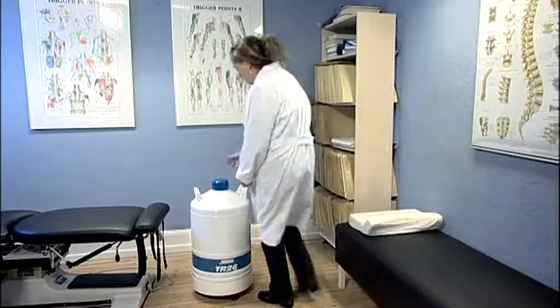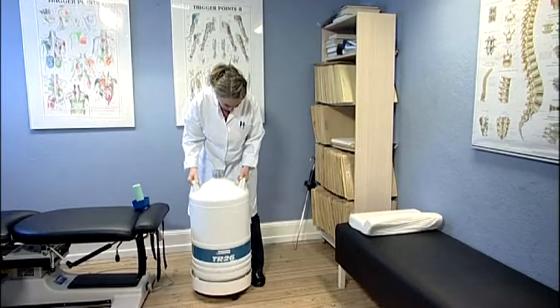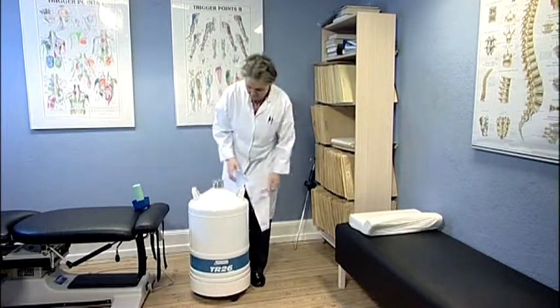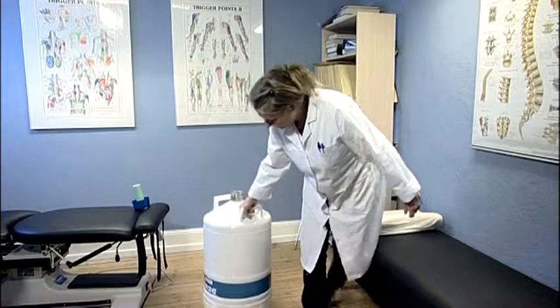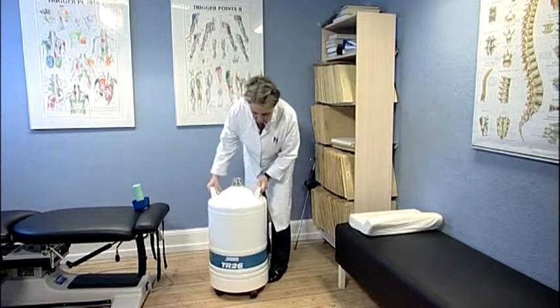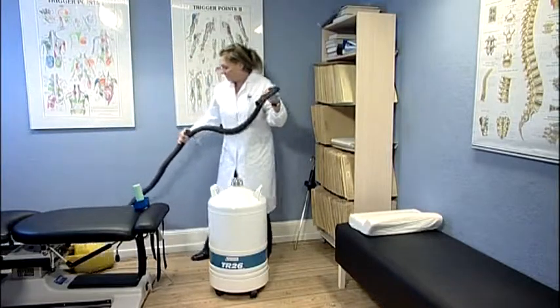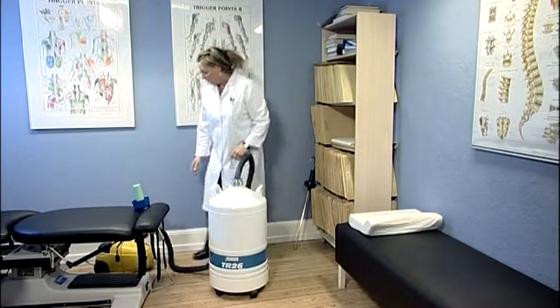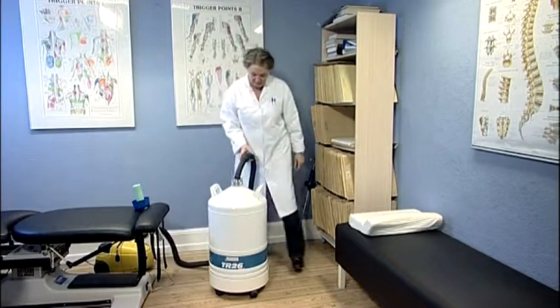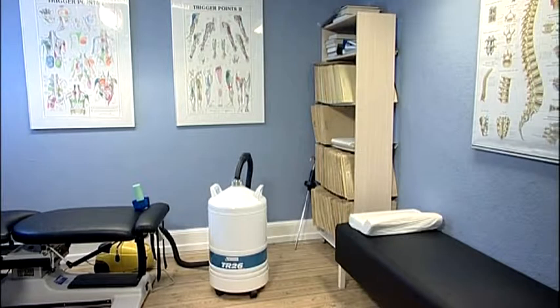Over time, an increasing concentration of ice crystals may be noticed in the container. Also, particles are worn off the cork when removed and reinserted into the container. We advise to clean the container 1 or 2 times per year prior to refilling. Take the container outside and make sure to empty it completely. Then dry out any remaining water. For this, a vacuum cleaner can be used to create strong air ventilation for 20 to 30 minutes. The container is now clean and ready to be refilled.